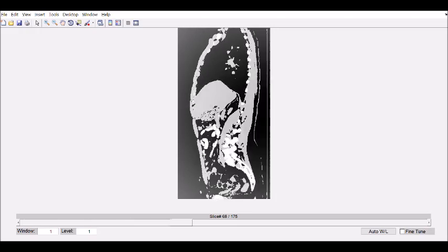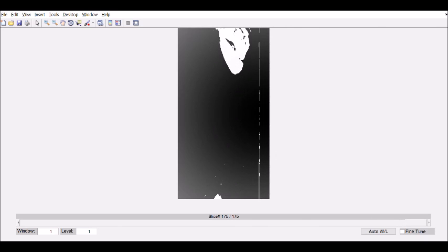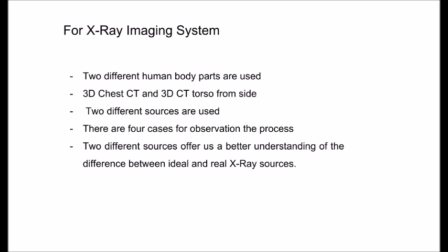Here you can see our 3D CT scan model. For the dataset, we used the VoxelMan library as the source. We prefer 3D CT images since CT is a 360-degree projection of X-ray. After creating the 3D model, the bone, muscle, soft tissue, and air are segmented for the purpose of distinguishing them from each other in the downloaded PNG formats.